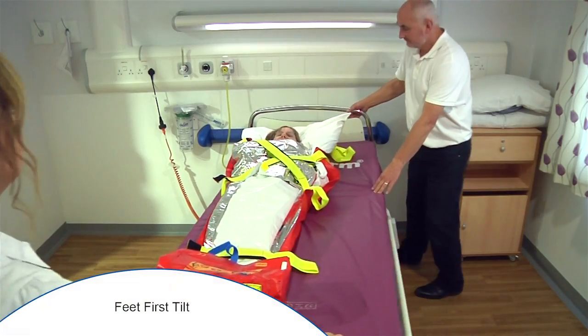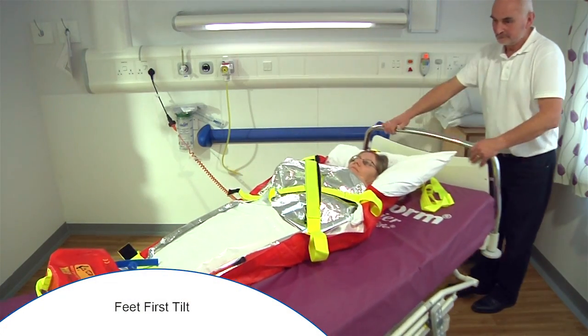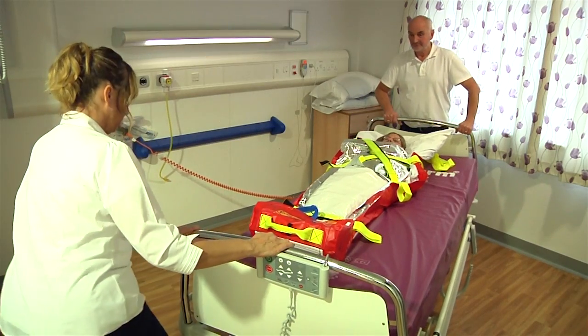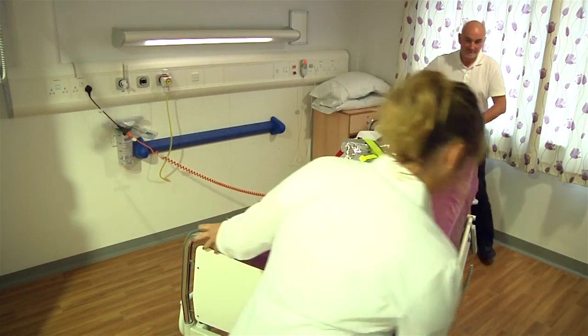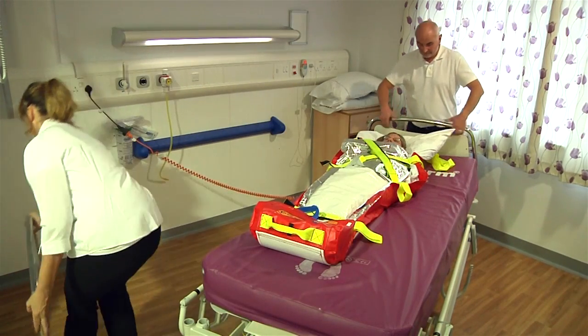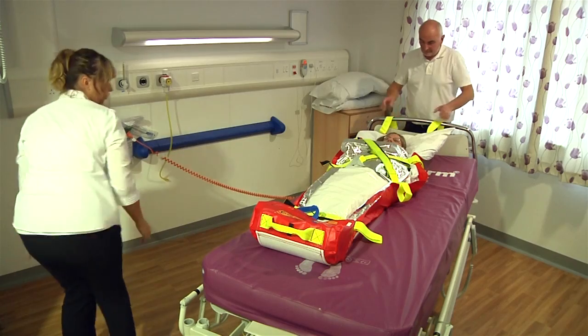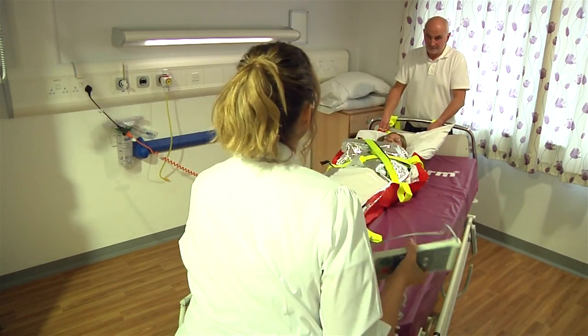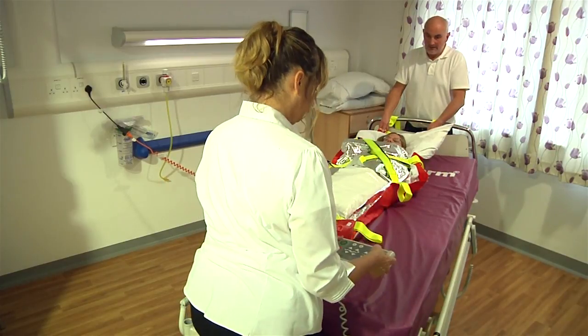If the type of bed and space allows, the bed can be tilted towards the foot end. Remove the foot end of the bed, lower and tilt the bed. Right, Linda, we're going to lower the bed and then we're going to tilt it, okay? Okay.